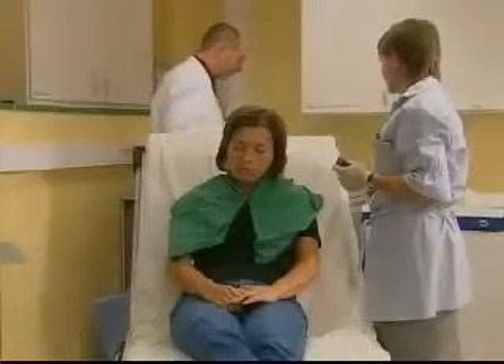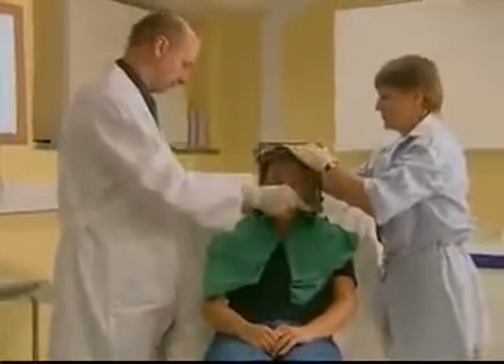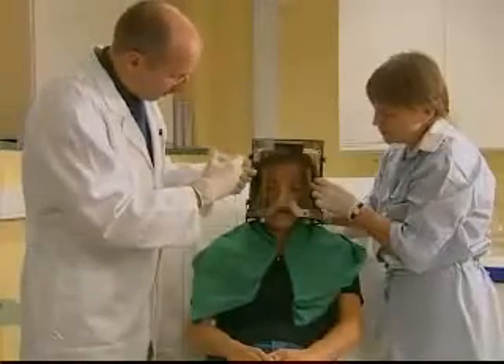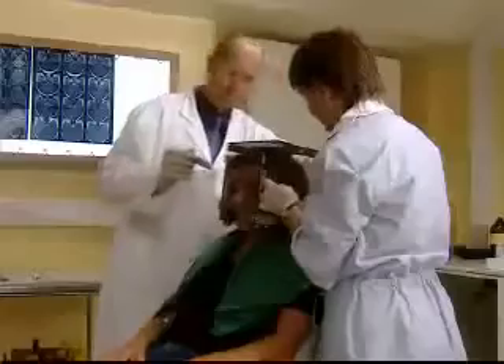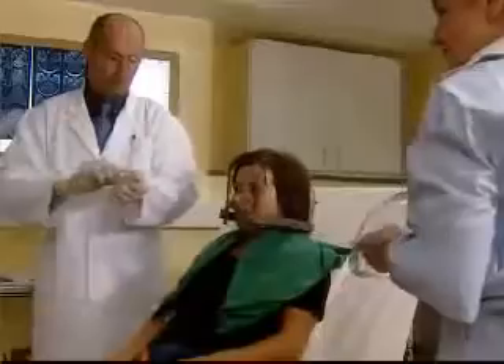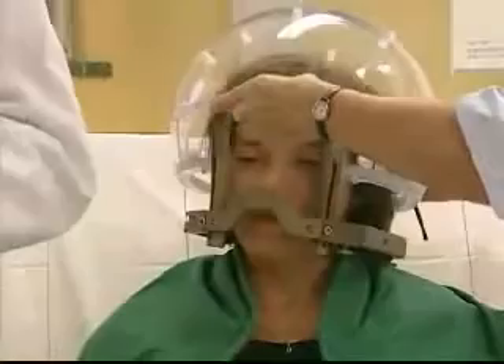Before treatment, your doctor will inform you about the entire procedure. To begin with, the lightweight frame will be placed on your head. Your hair doesn't need to be cut or shaved. Local anesthetic is applied where the frame is to be attached. Once the anesthetic has taken effect, the frame will be fixed to your head with four screws. The frame remains on your head throughout the entire procedure, in order to keep your head in a stable position during imaging and treatment. Attaching the frame takes about 15 minutes.